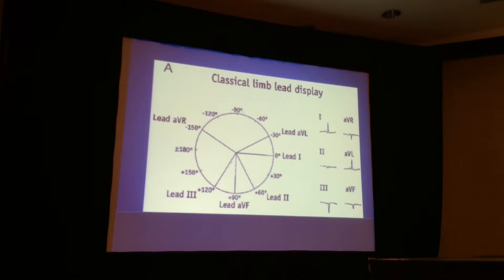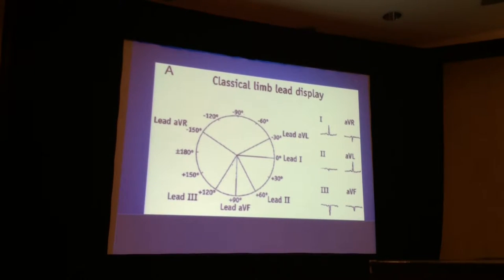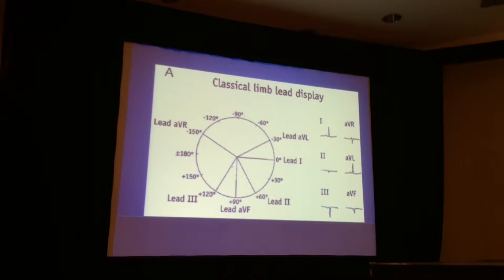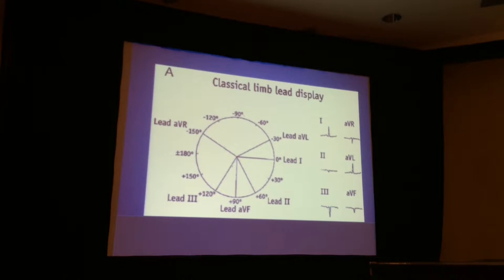So, as I have learned, this was the way we looked at the limb leads: I, II, III, aVR, aVL, aVF. And of course, that meant that aVR was looking from a view quite different than the typical views of the other leads. But as you can imagine, any lead has its antipode or its reciprocal. So aVR also has a minus aVR, just as lead I has a positive lead I and a negative lead I. But we don't think of the negatives of any of the leads, and therefore we think of the positives of all the leads, even though the positive of this lead is a view from a very different direction.